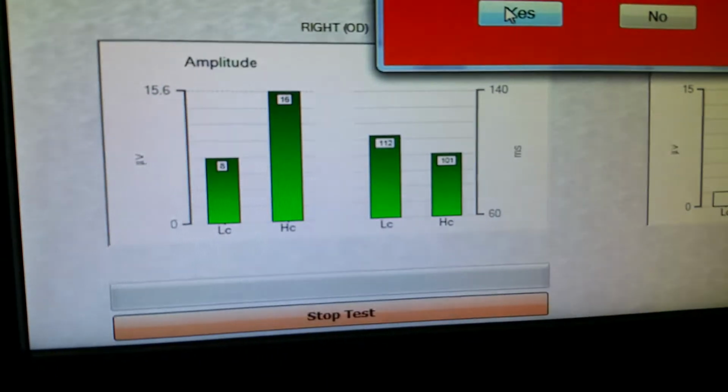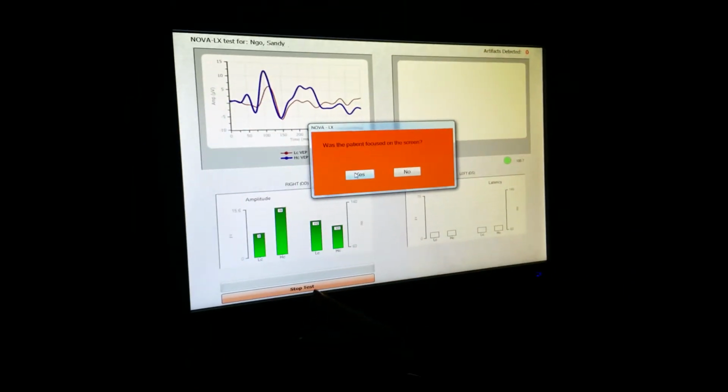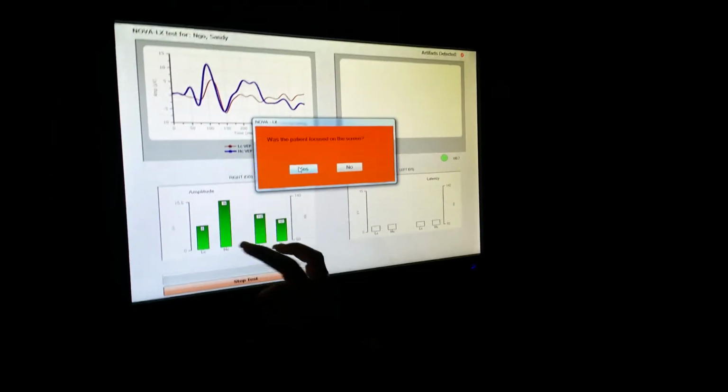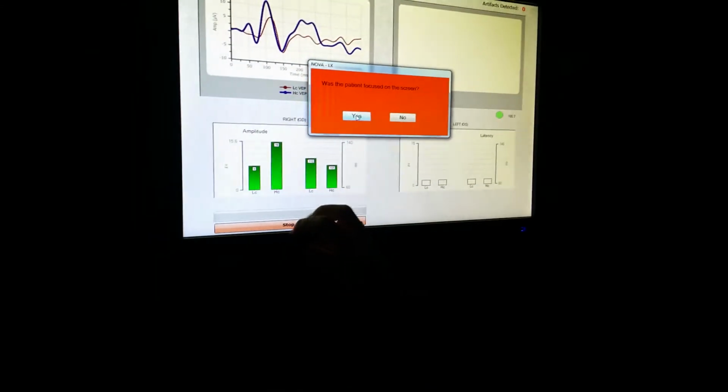Okay, and then you see our readings here for the high contrast. High contrast is not as smart, okay? So regardless of whatever you get for high contrast, whenever it pops up and says, was the patient focused on the screen, if you say yes and you're not paying attention to what you get, it's not going to know to repeat. So you have to physically look here to make sure that you're getting colors, okay? So we're going to say yes because we do have colors.